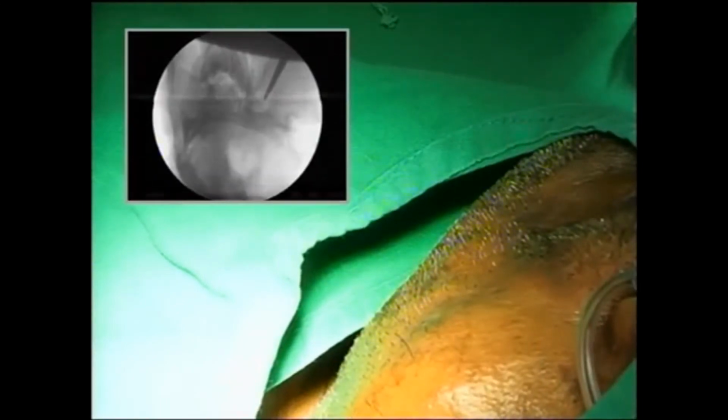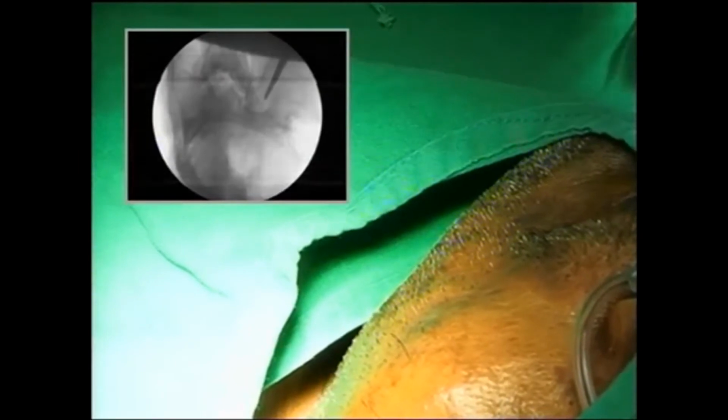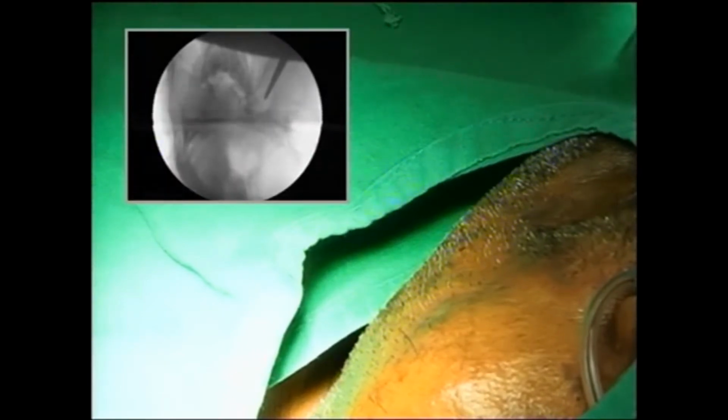So even though it may be a little bit difficult for the patient itself, a little bit of mild conscious sedation is acceptable. And if your patient is awake and aware of what's happening and is reasonably comfortable from pain, that gives you an invaluable support. Okay? So same RF needle.